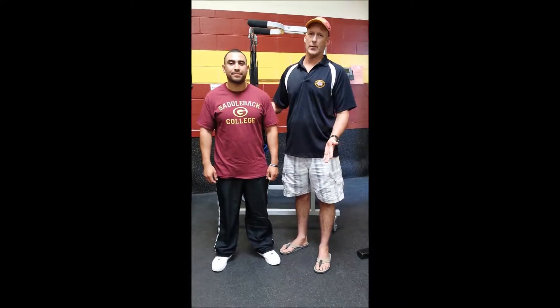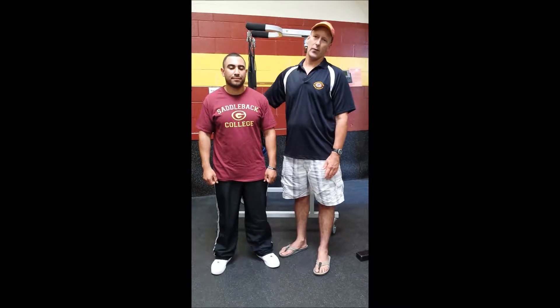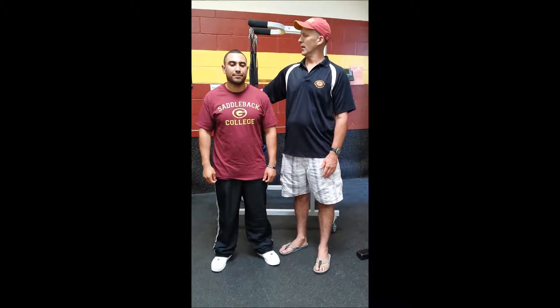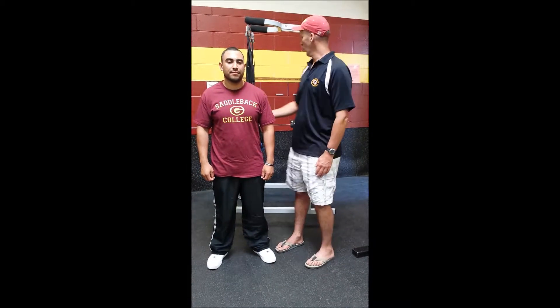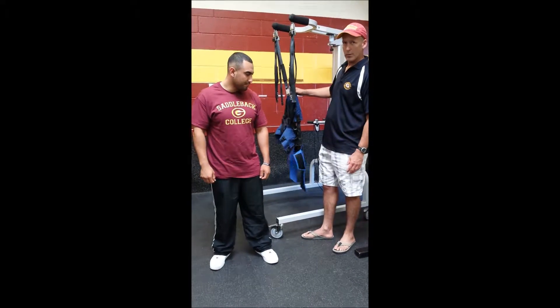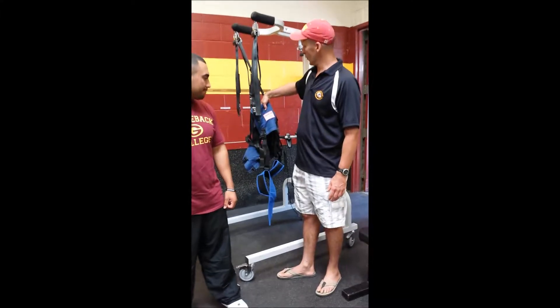Let's say Tim has had a traumatic brain injury, and he would not be safe on a treadmill — on a running belt — with his poor balance walking. So what we're going to use is the partial body weight support treadmill. The one we have is made by Lightgate and Mobility Research.